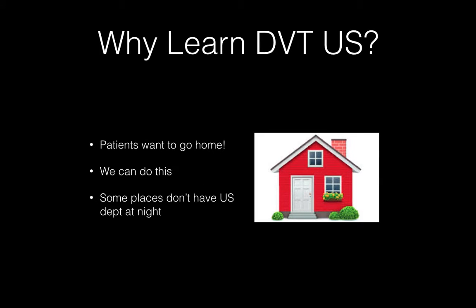So first of all, why learn DVT ultrasound? Patients want to go home. They prefer not to wait hours in the ED for their imaging study if they can avoid it. Currently, even though we are not allowed to do these without getting a confirmatory study, there are some places where the ED physician is expected to know how to do these, and there may be some places where you don't have an ultrasound department at night, and so you're faced with the dilemma of, well, do I wait until the morning to have them get a scan, or can I just try to scan them now, see if I can see a DVT, and then they can have a confirmatory study in the morning and I won't delay any of their treatment or care. It's also fairly easy to do. You just have to know what you're looking for and how to obtain the images and practice it.